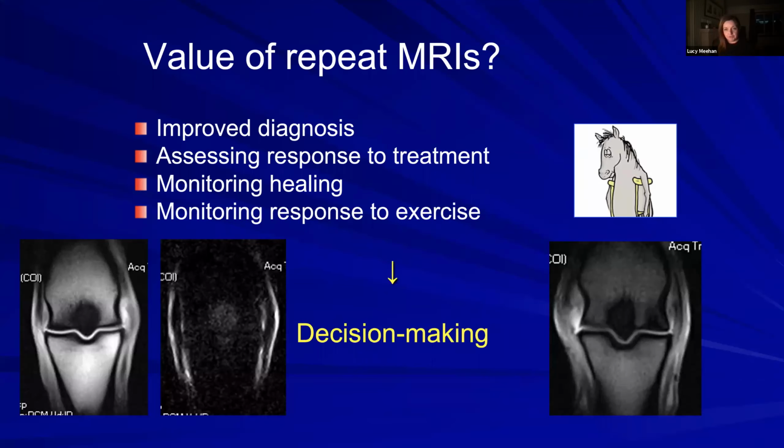Looking at the unusual fetlock patterns that you discussed in the endurance horses in response to training, do you think this is occurring more in a specific discipline, for example endurance horses, or do you think that these horses are just MRI'd a bit more regularly and you're seeing it more?